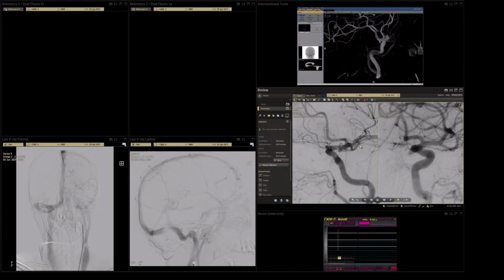Okay, for the navigation, the guiding catheter is a Fubuki through the short sheath, 7 French angled one, and a Vasco 21 with the Leo Plus 3.5 by 25 will be placed in the ICA.